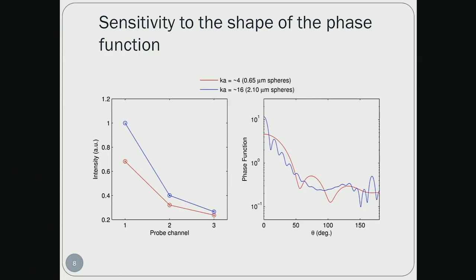And as you get closer to the diffuse regime, you can see that the two curves converge because at that point, you're really measuring just high order scattering, which is losing its sensitivity to the phase function.